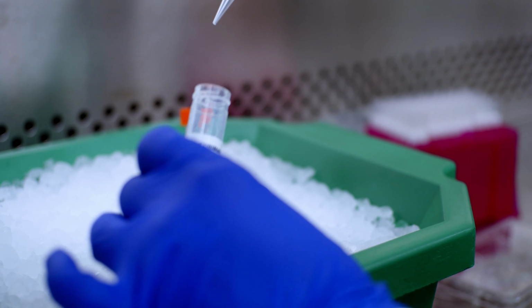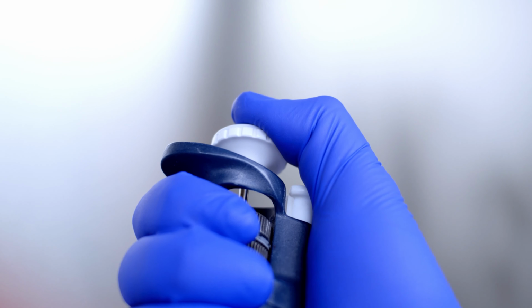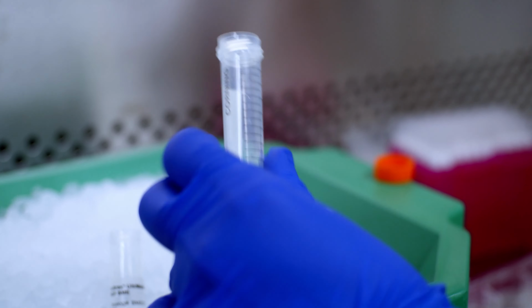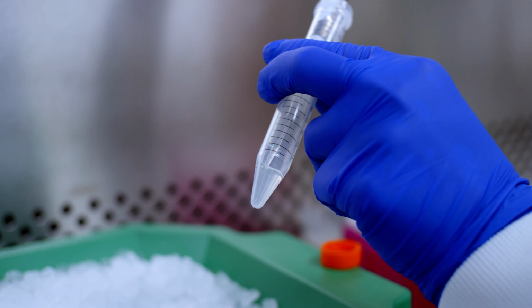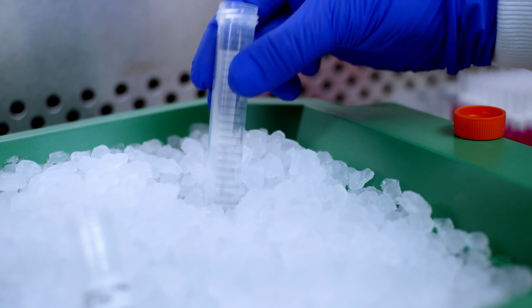Using cooled pipette tips, mix thawed organoid qualified Cultrex BME or Cultrex Ultimatrix BME by pipetting the solution up and down. Avoid introducing bubbles during this process. Dilute the organoid solution directly in ice-cold Cultrex BME and mix thoroughly. A final matrix concentration of greater than 8 mg per milliliter is recommended to ensure dome formation.